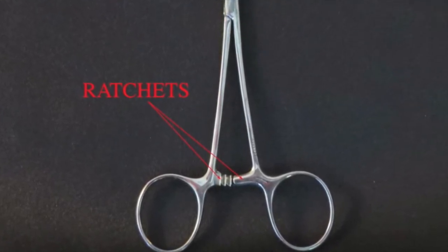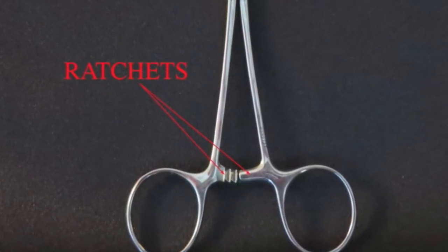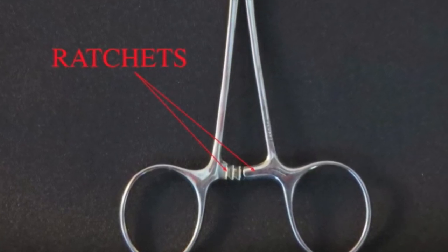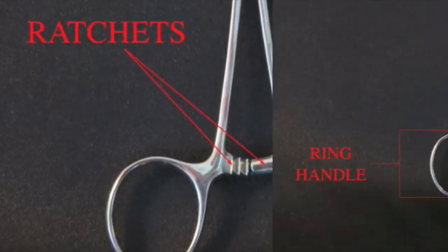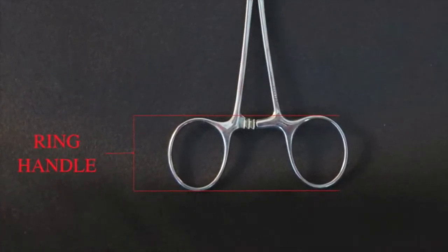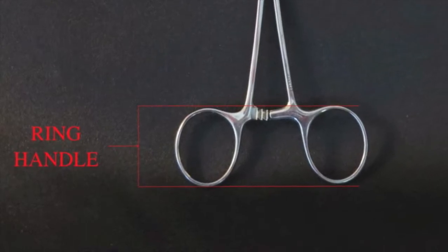The ratchets lock together and hold the jaws closed at different positions. Note that not all ring-handled forceps have ratchets. The ring handles are used to operate the instrument.